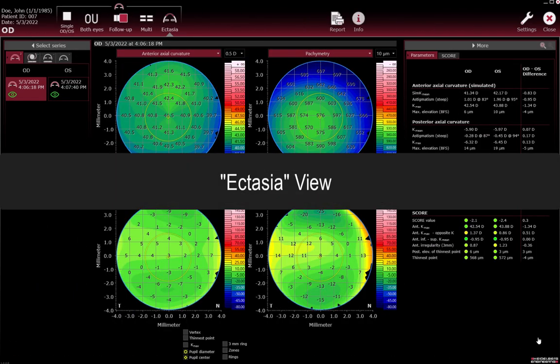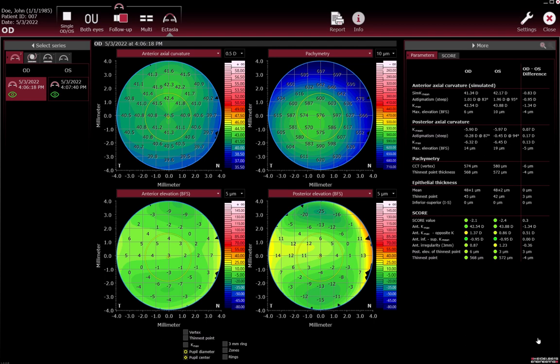Ectasia view. Possible ectatic changes in the cornea can be analysed in the Ectasia view. This view focuses on the parameters that are suspected to be indicators for ectatic changes in the cornea, and it provides specialised viewing tools for a quick visual assessment of the relevant parameters.